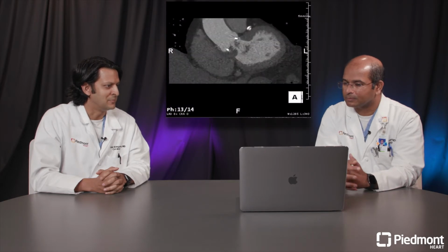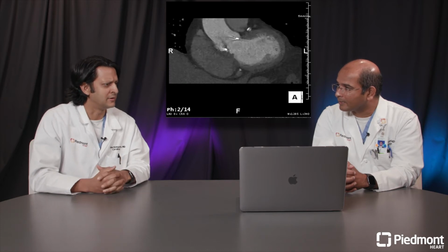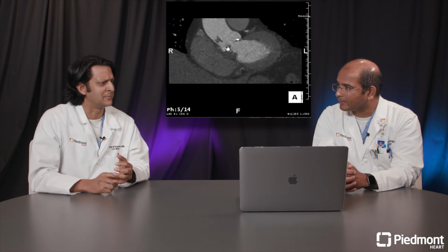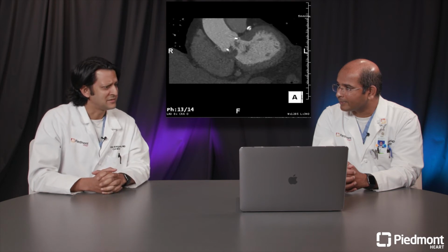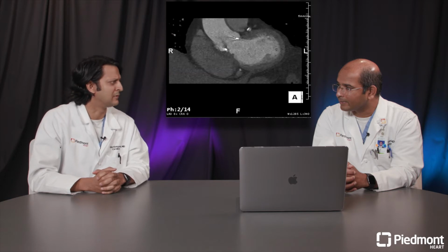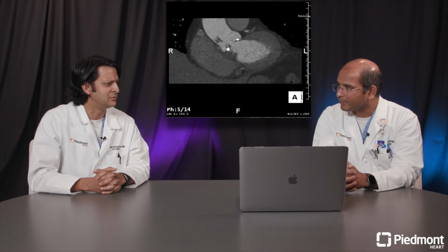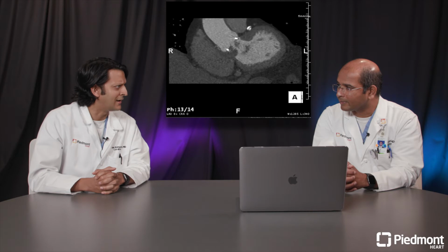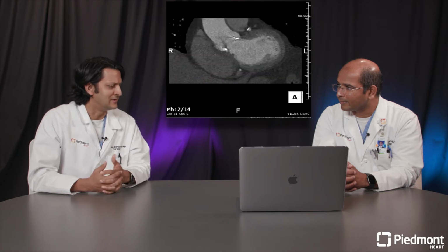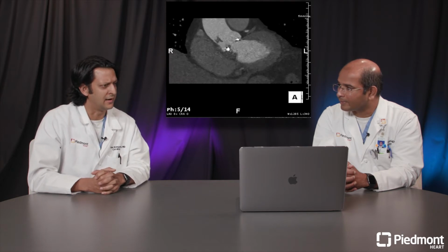And in this time of COVID-19, as we mentioned earlier, one of the things that we're trying to avoid is procedures that will not only take up extra personal protective equipment, but also procedures that potentially could aerosolize the virus and put healthcare workers at risk. Transesophageal echo is typically what we would do in this situation to better evaluate these valves and to look for some of the complications of endocarditis. However, in this time, we're looking for other methods of trying to evaluate these valves.